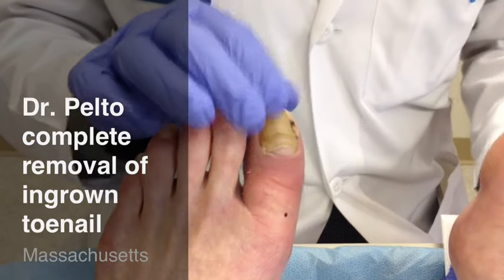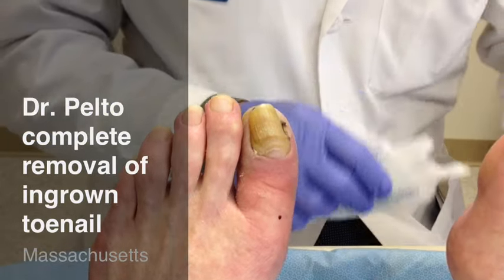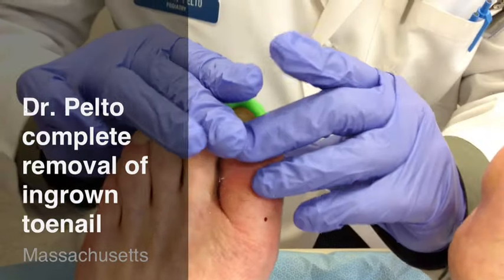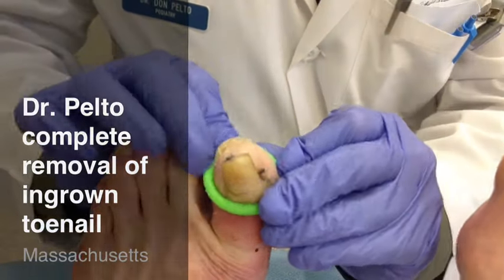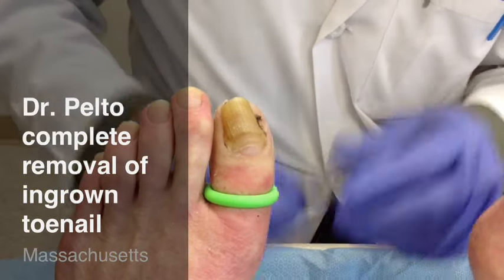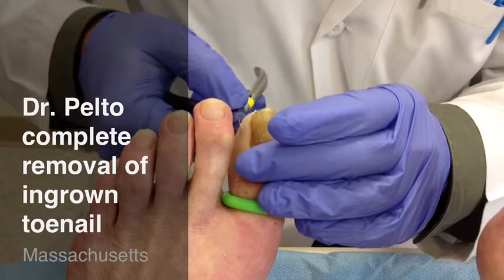In order to do this procedure, we need to first use a little tourniquet. This is put just to protect any of the bleeding in the area. And we test to make sure that there's no pain in the area.